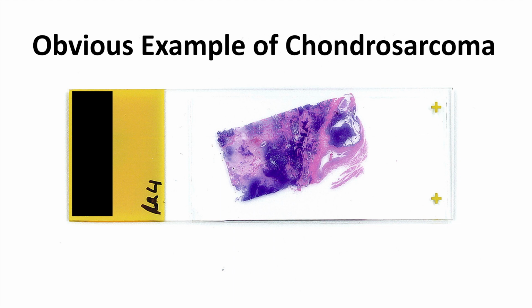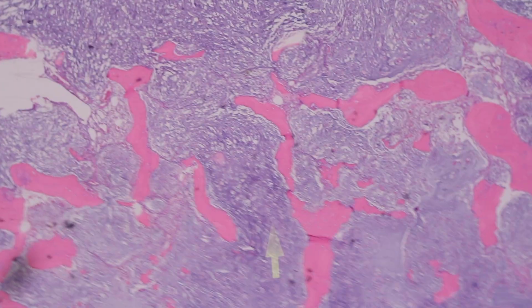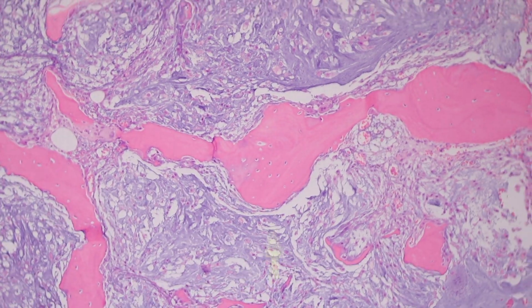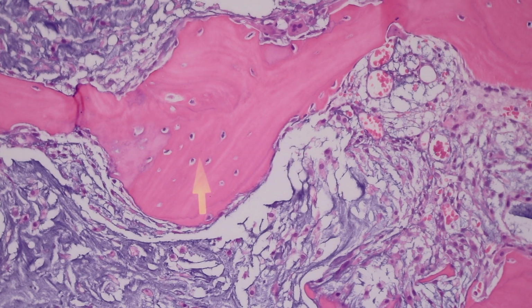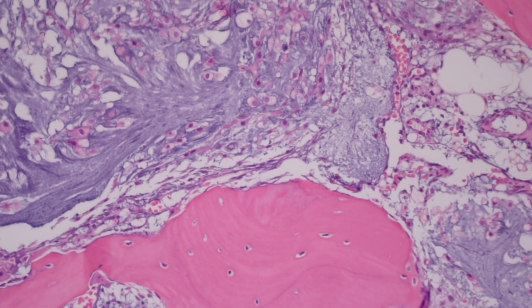And so you can hear what Dr. Rosenberg has to say about this case now. So this is a beautiful example of infiltration. Yes. So we have pre-existing bony trabeculae completely surrounded by the cartilage. And we can see the lamellar lines, right? So we know it's definitely bone. Yep, it's bone and it's pre-existing bone. So what you want to see is pre-existing bone, not reactive bone that is being encompassed by the neoplasm.